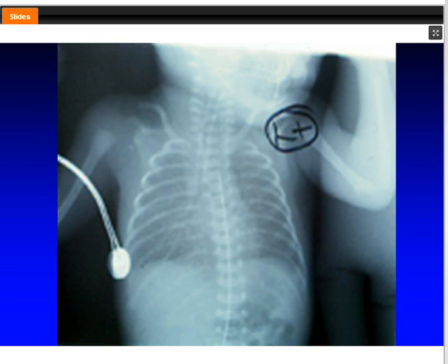And as I mentioned before, once you get into chronic lung disease, you need to start going down on the frequency. And if you do that, you will not overinflate this lung, and you'll be able to continue to wean the oxygen level. So what about extubation?